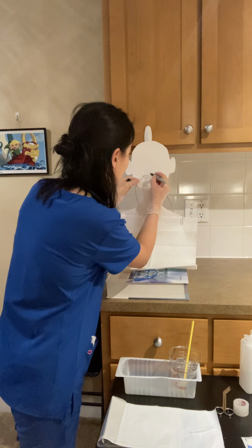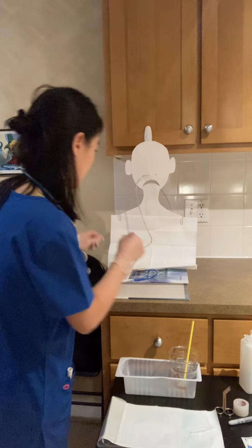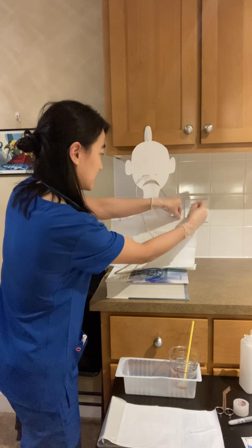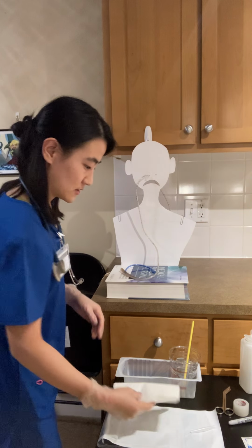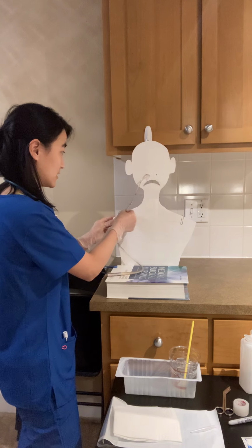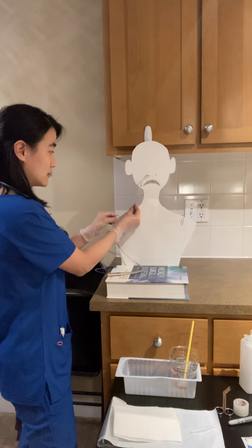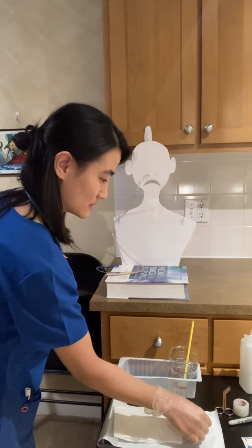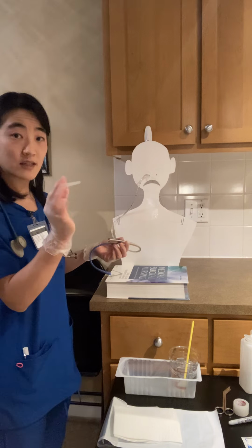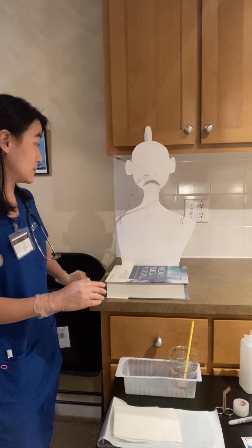Alright, and now that I have confirmed the placement of the nasogastric tube, I'm going to mark the tube right under the nares. And I will remove the towel now. And I'm going to connect the nasogastric tube to his gown and make sure that there is plenty of slack so that it doesn't pull if he moves. Alright. And then I'm going to take the connector piece and stick it into the end of the nasogastric tube and then connect it to the room's suction.